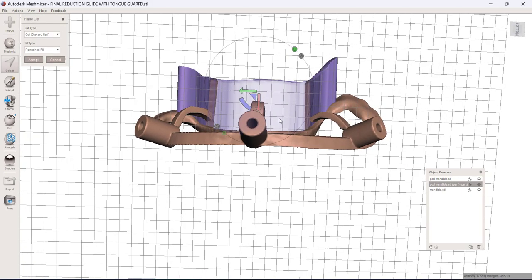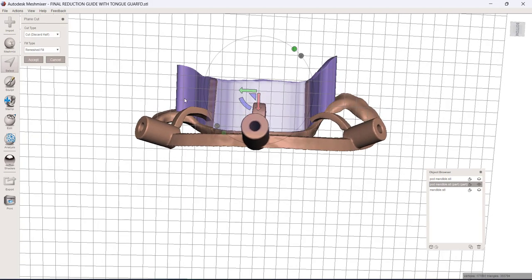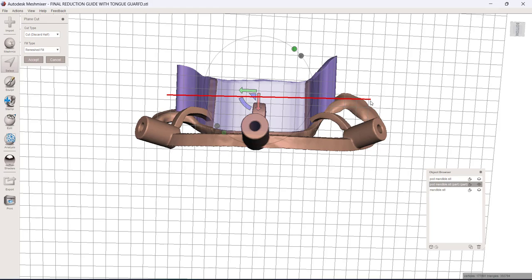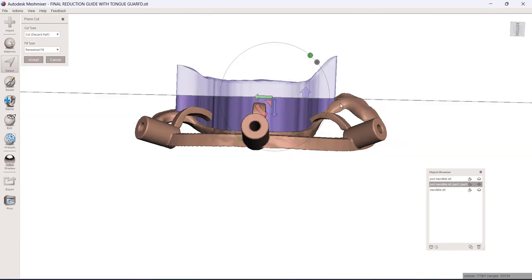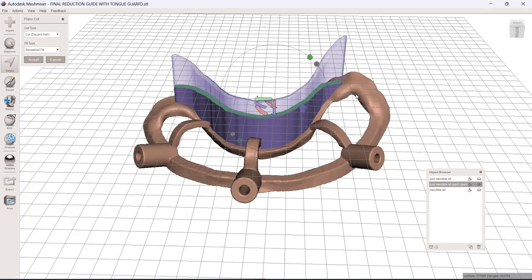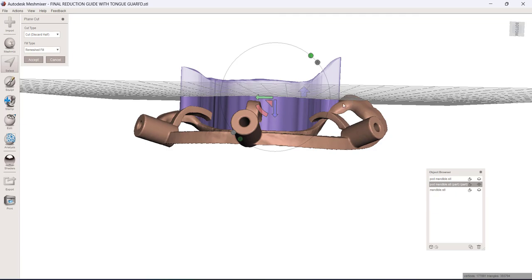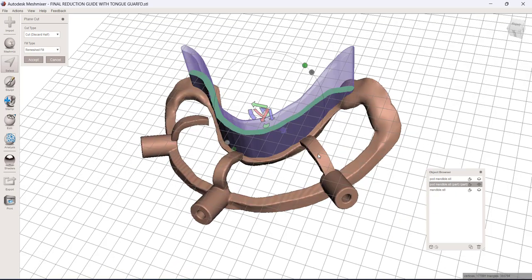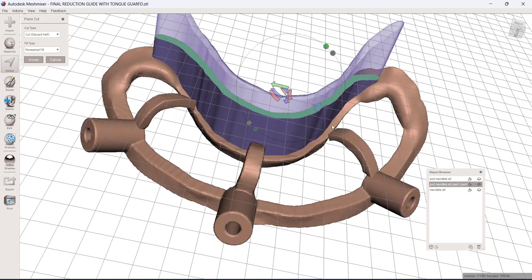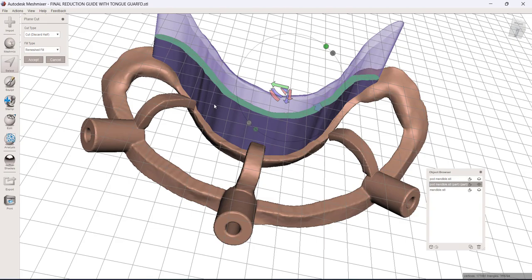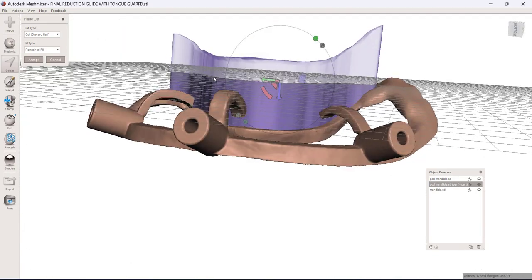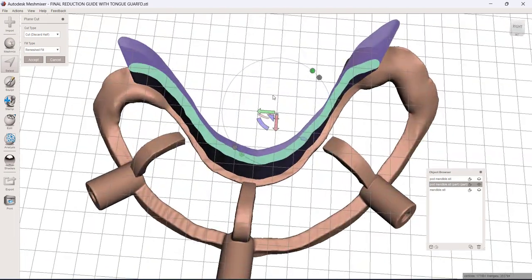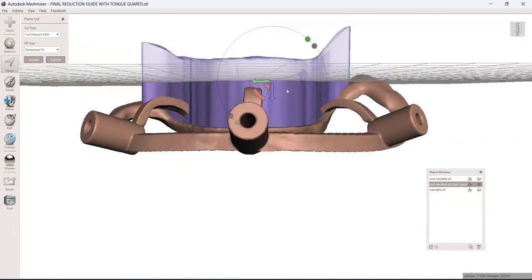And now I'm going to go to edit and plain cut. And so very similar to the other plain cut tool, it's going to just do a plain cut. But the difference with this one is it will only apply it to what's been selected. So you can see here, I would be cutting through my actual reduction guide here. But since I've done it through the selection menu, it's only going to apply that plain cut to whatever was selected.